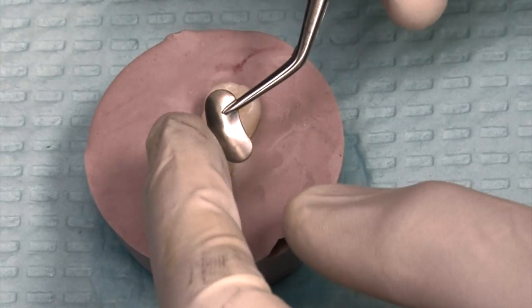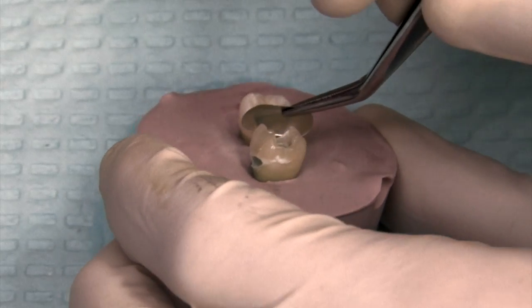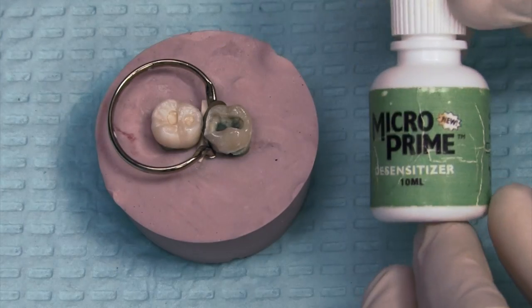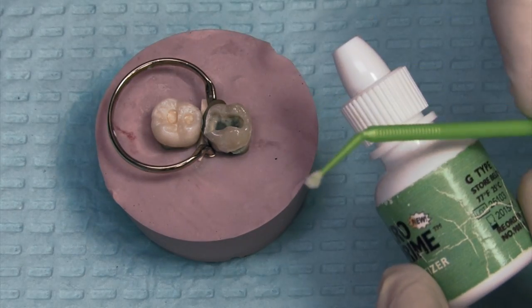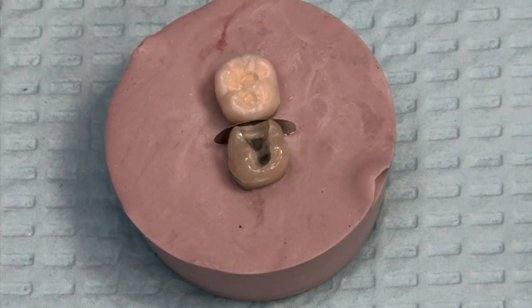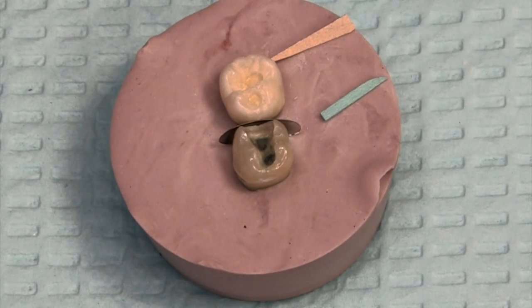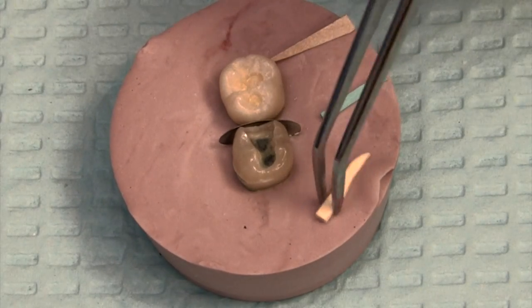There's the prep. We use the Garrison system, the sectional matrix. The convex part is going to face towards the gingival. We'll just slide that in with the cotton forceps and hold it in place while we insert the wedge. These two teeth are separated further than we would normally see clinically. Most of the time I'll use that light blue wedge — probably 95% of the time. But in this case it's just too loose to fit in there. Looking at the shape of these wedges, it looks kind of like a canoe, and the part that would be in the water faces gingivally. It's important to get it oriented the right way so the contact will have the right shape.